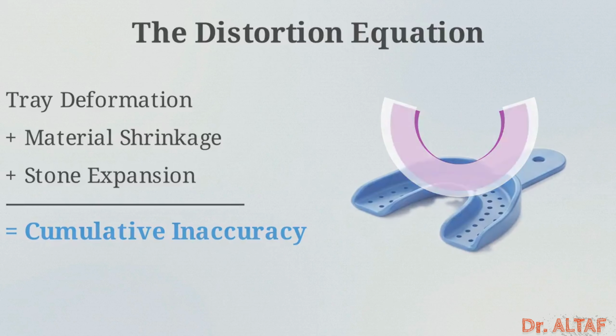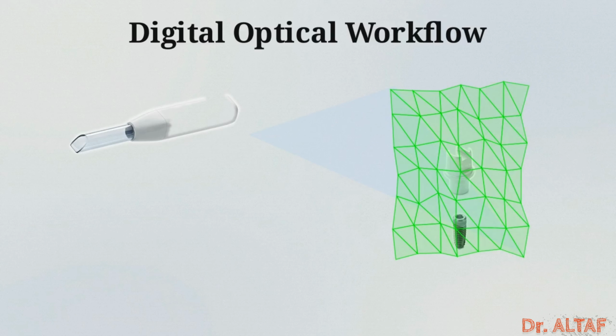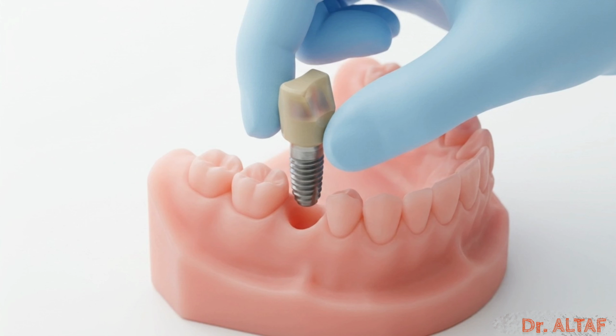The digital workflow bypasses these variables. An intraoral scanner emits light directly onto the arch, translating the reflection into a pristine STL surface mesh. Instead of traditional impression copings, the clinician places a scan body.